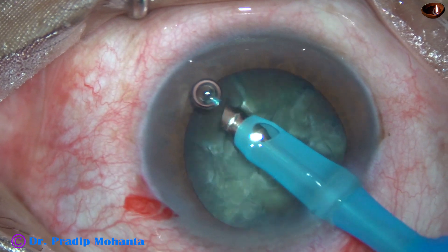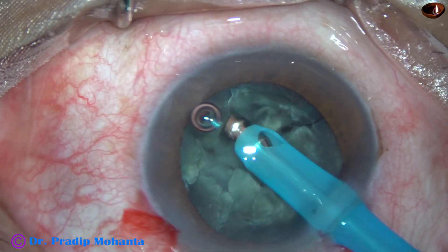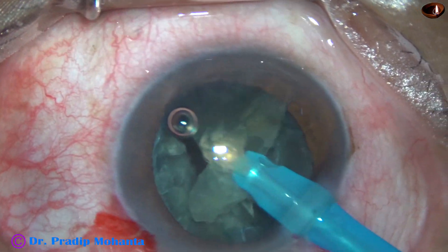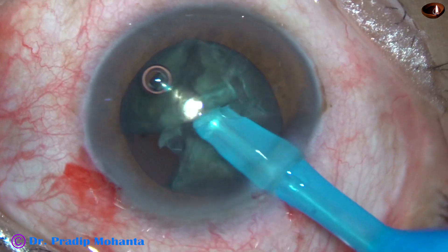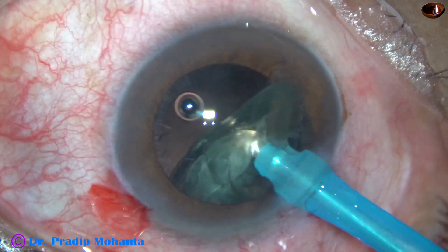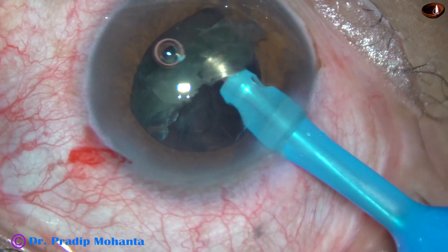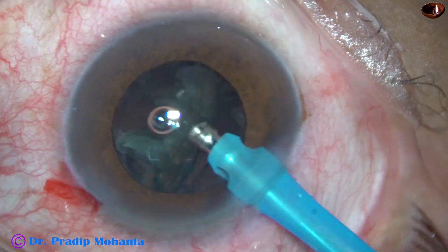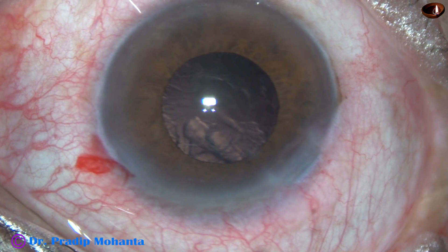I am looking for a free nuclear fragment — and here it is. I hold this piece and emulsify, and the other pieces follow. Now the semi-nucleus is tilted. Emulsification is started from the central part, and the pieces are mobilized in such a way that we don't catch the iris. We have completed the emulsification.